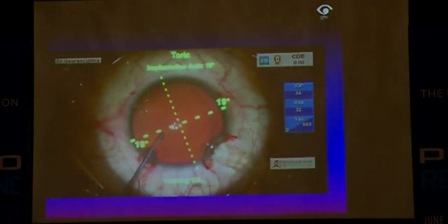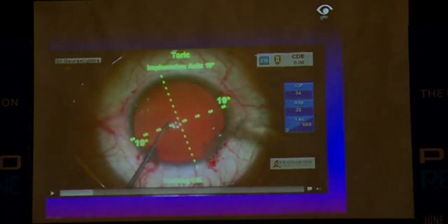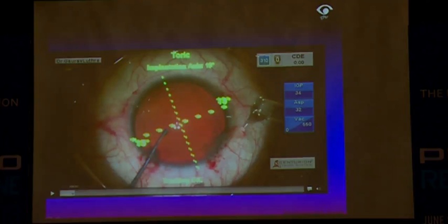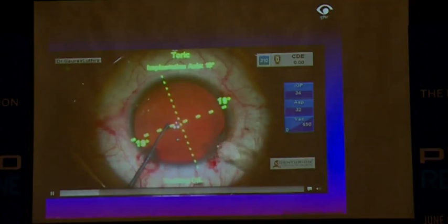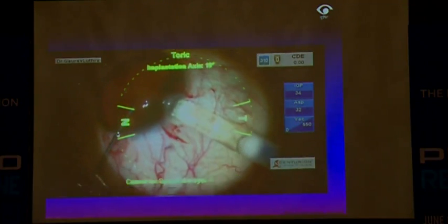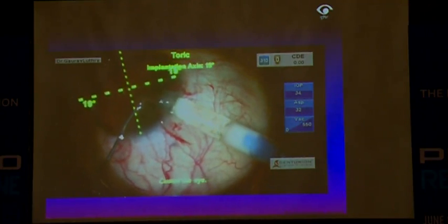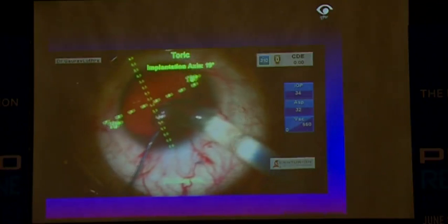Looking at this small video, now another small pearl, you can see what happened here. As I started to inject over here, at the tip of the cartridge you can see a small portion of the ICL jutting out. I was just looking at it under the microscope, and I thought I'd be able to get through. Sometimes when you load it and your assistant keeps it for a while and then puts it back, you have to be extremely careful that the tip is not projecting in front.